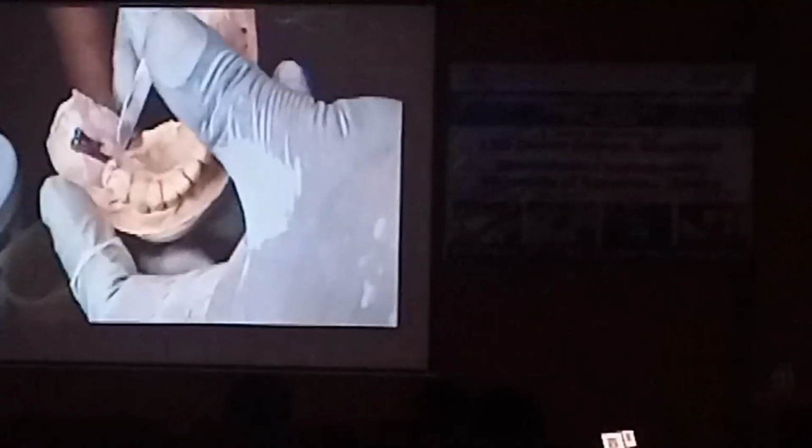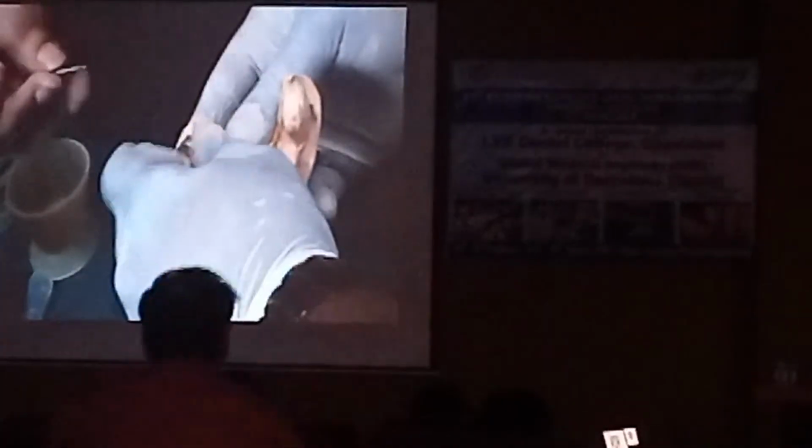Anyone who is not a prosto PG, now it is a very good time to make them your best friends. Try your best, prosto people are your best friends. They know about all this. They use it. So this is a mask which, as you can see, I can remove from the cast. It just represents my soft tissue profile. Now we have the section pieces there, and we will put it here.